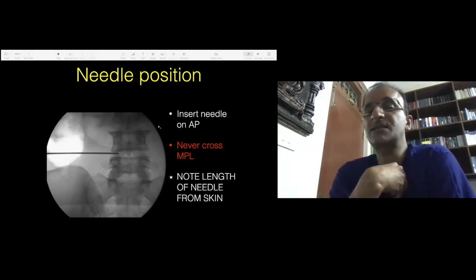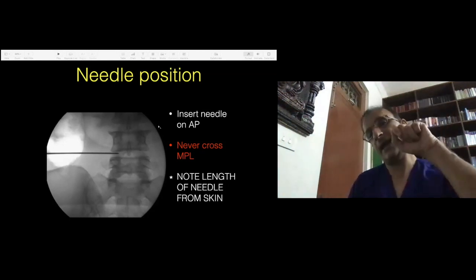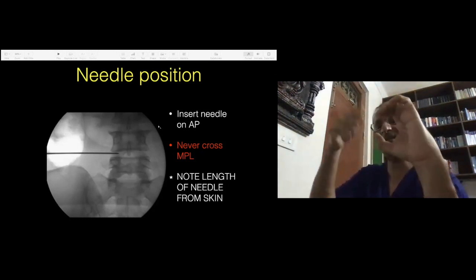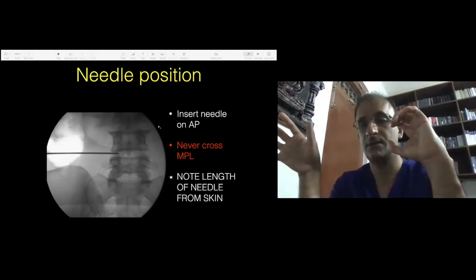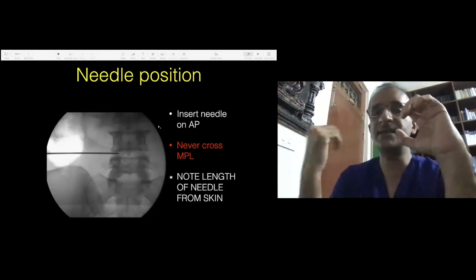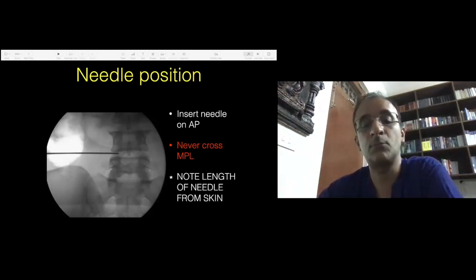So I ask my assistant to keep a hand on the thigh and leg when I am docking the needle, inserting the dilator, and inserting the sheath. Once the sheath is inserted, everything is in front of me and I can see it, so my assistant removes the hands from the thigh and leg. The minute I touch the nerve with the needle, my assistant tells me that the muscle is moving, so I have to redirect myself. That is a very good way of monitoring intraoperatively.